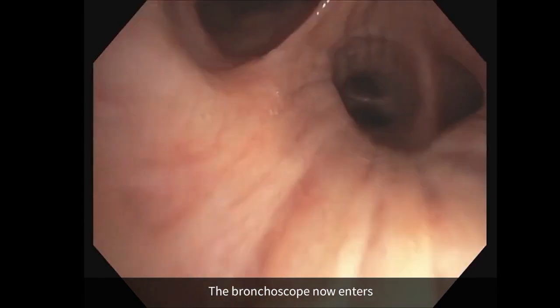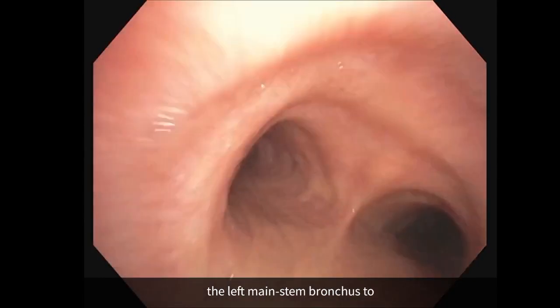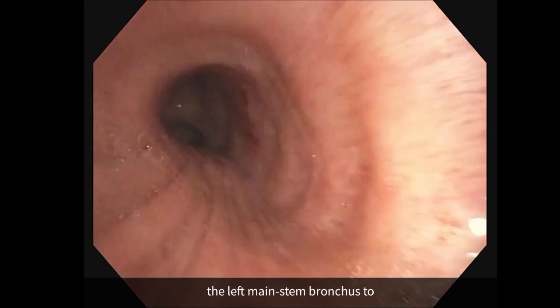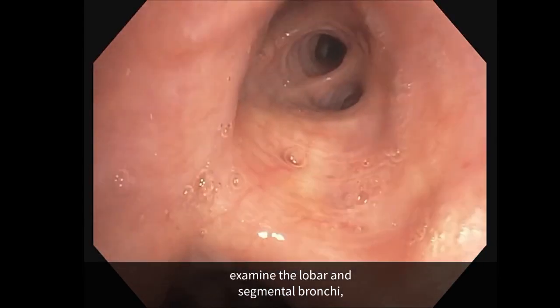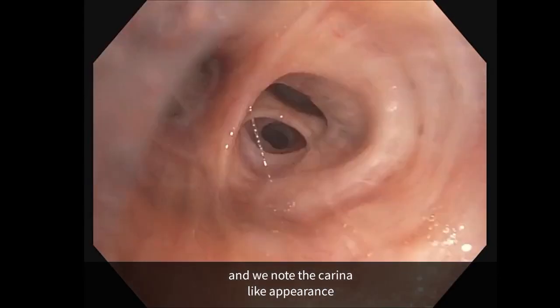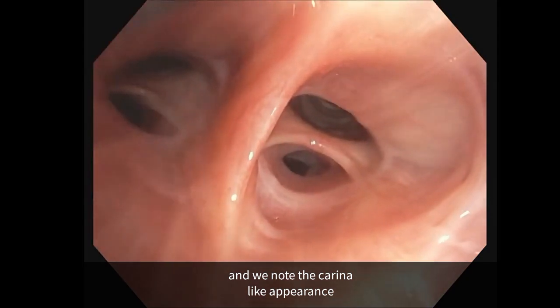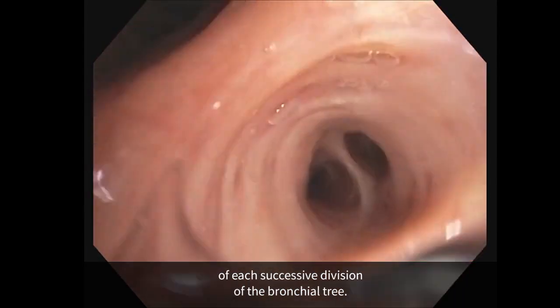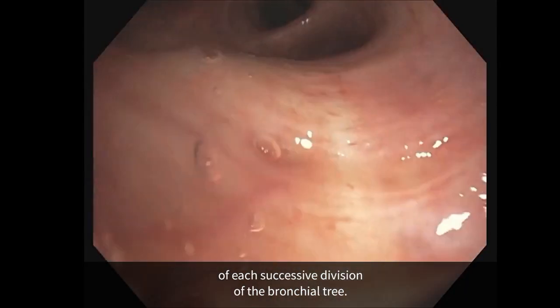The bronchoscope now enters the left mainstem bronchus to examine the lobar and segmental bronchi, and we note the carina-like appearance of each successive division of the bronchial tree.